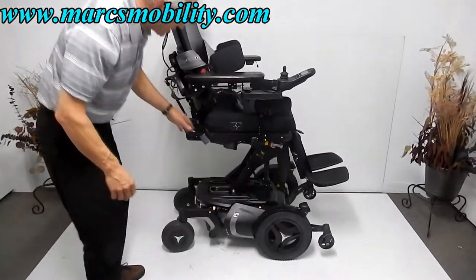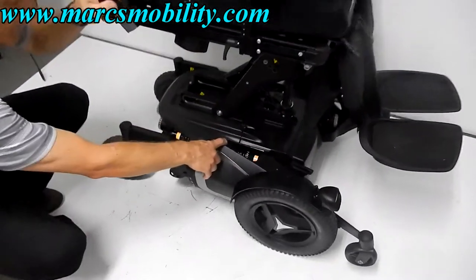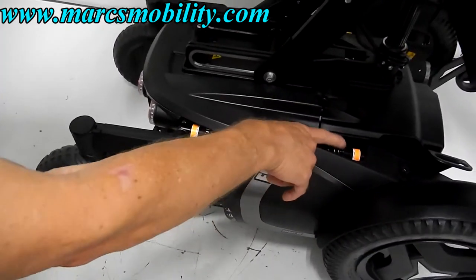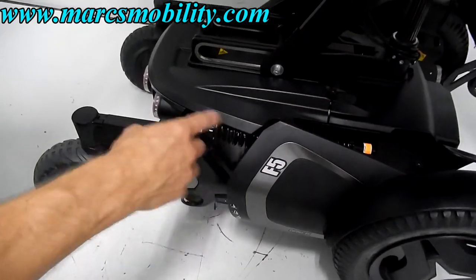This chair also has double suspension — a front suspension and a rear suspension. The rear suspension is adjustable by turning a ring; clockwise tightens the springs. You can adjust both sides.